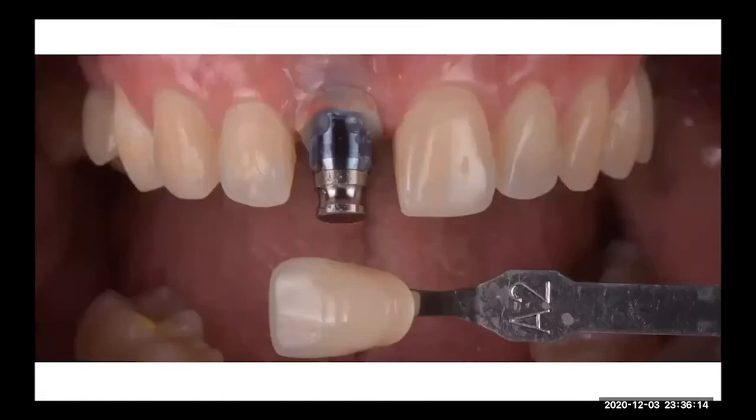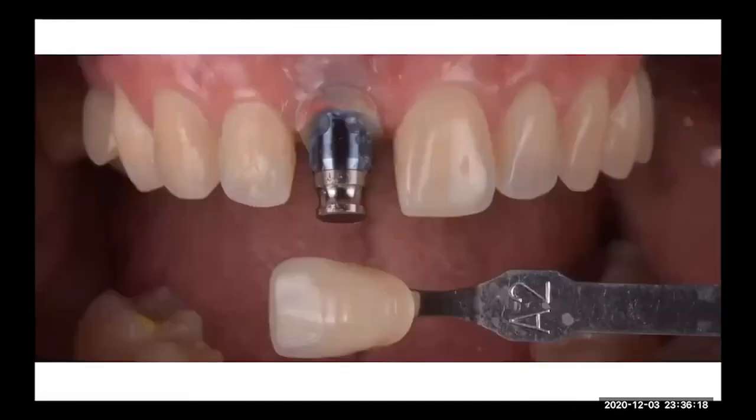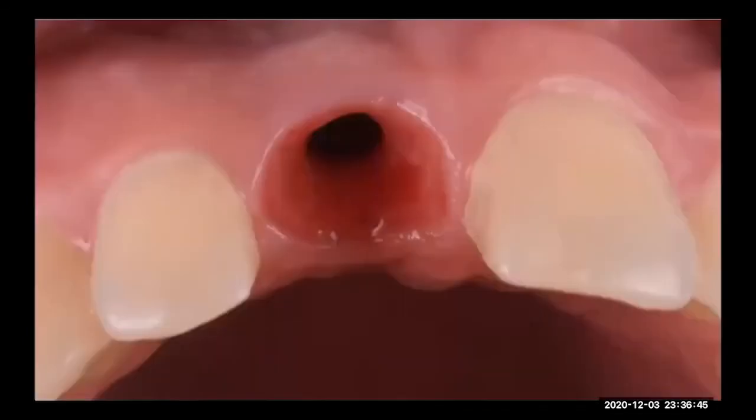So this is a tooth that has a root resorption, and the doctor places the implant, then tries to take the impression and tries to take the color. But for me, that color is wrong because he already manipulated the tooth, he already manipulated the mouth. For me, that color is wrong because the tooth at this point is dry. So I try to explain to the doctor, but anyway, we make the crown, we try to match with the color he sent to us.